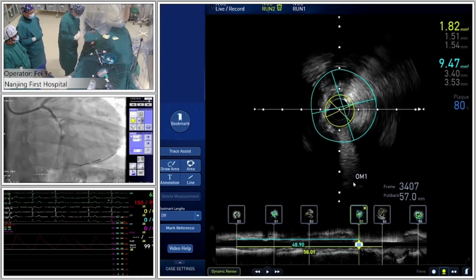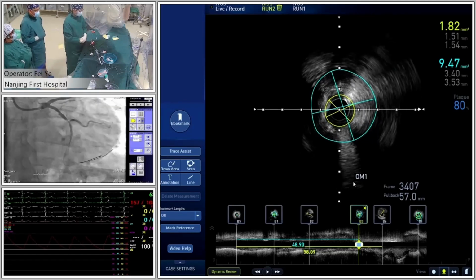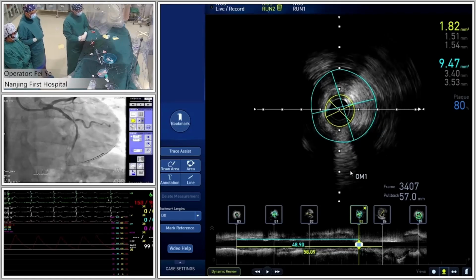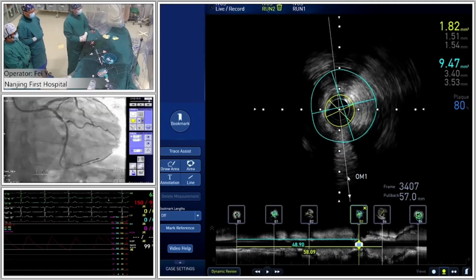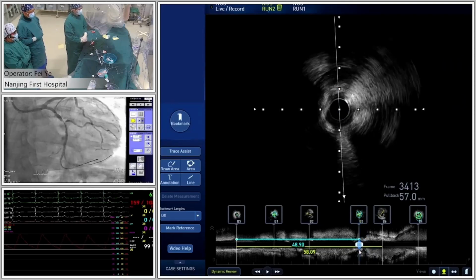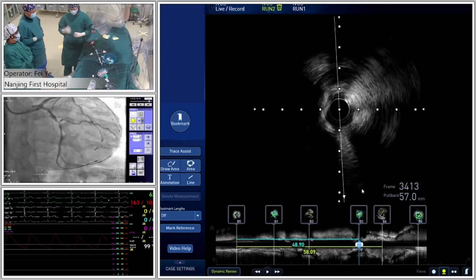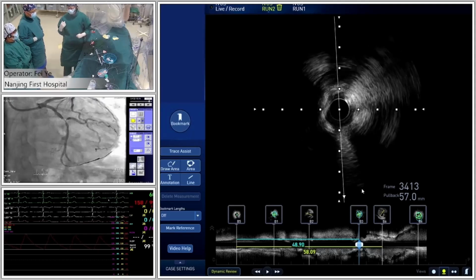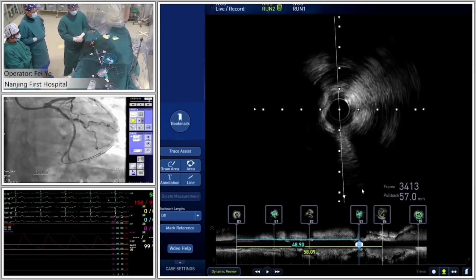So we can see the lesion characteristics was eccentric, without any calcified lesion. And the ostial OM was very stenotic, and the angulation was very sharp. We also have a microcatheter on the table, so we want to use this microcatheter. If still failed, we use a double channel catheter to support us to wire the OM, just because this is a very challenging procedure.